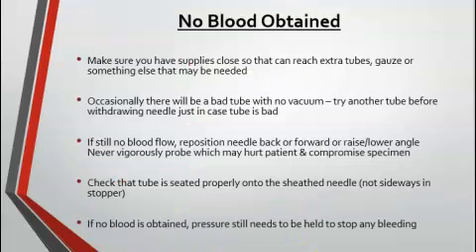Okay, sometimes inevitably in phlebotomy, you're going to stick a patient and end up missing a vein and not get any blood. So let's talk about what you're going to do in those types of situations and how to prep for a blood draw. When you're prepping to do your blood draw, make sure that you have all your supplies within arm's reach. Even have extra stuff, because you don't want to have the needle in the arm and need an extra tube and not be able to reach it.